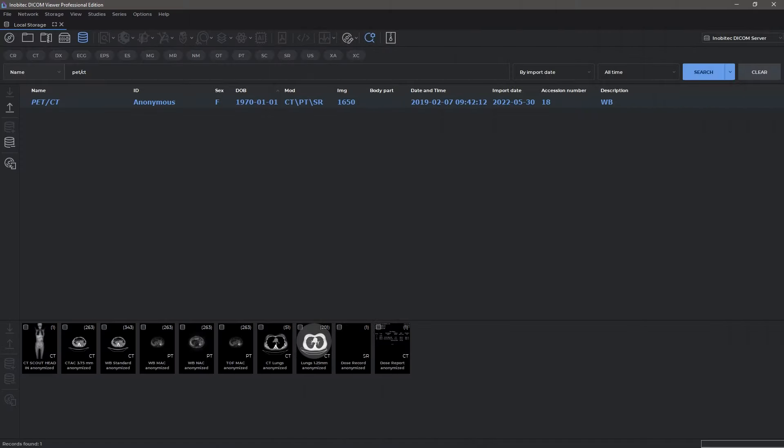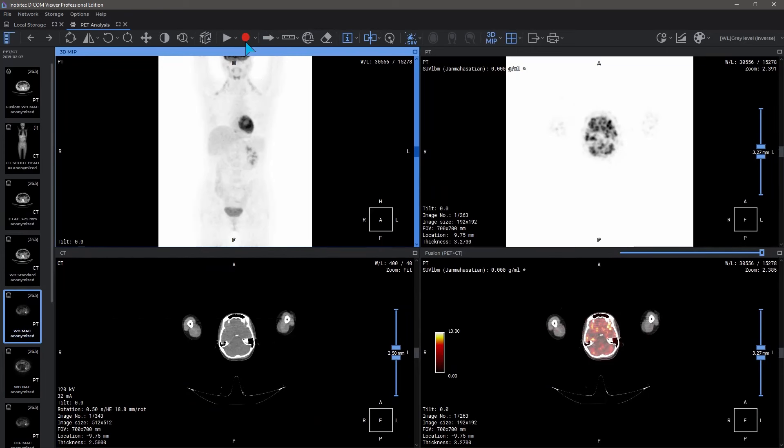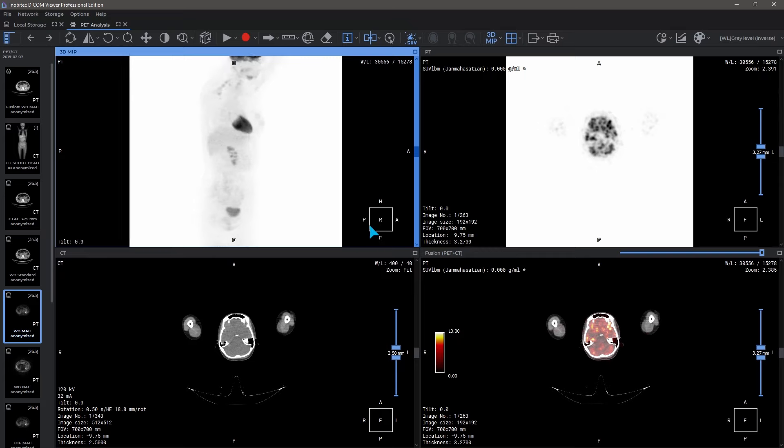Inobitec DICOM Viewer PET/CT Analysis Module. To work with the PET module, you need to select two series: CT and PET. Following that, you will see an active PET/CT icon which will open an advanced module with extended functionality.